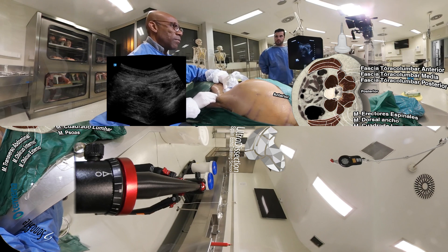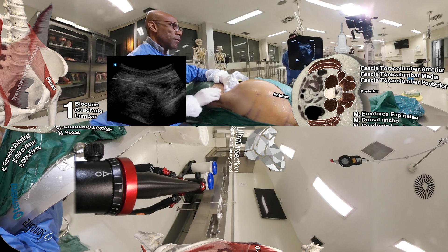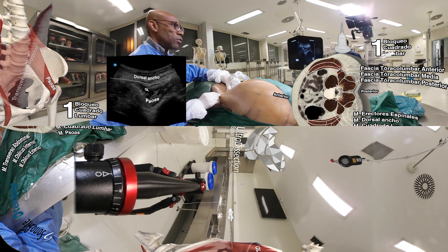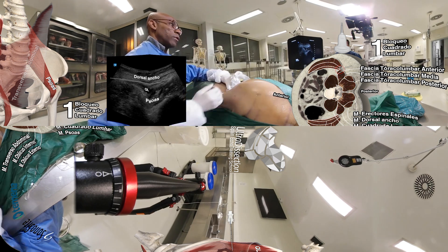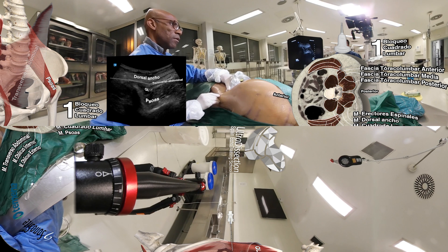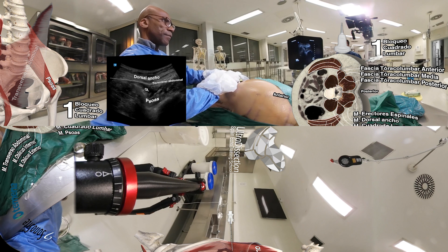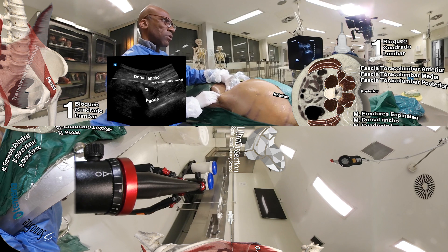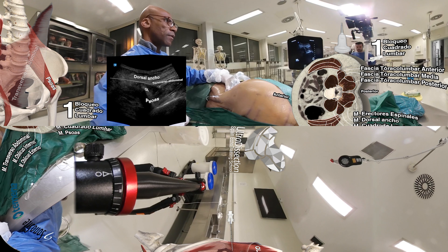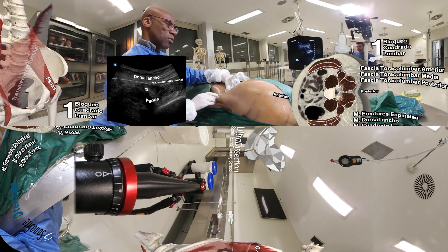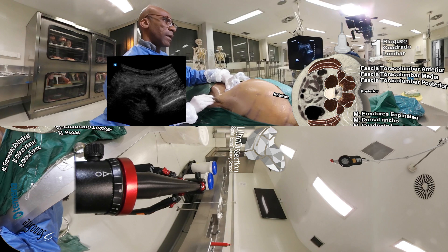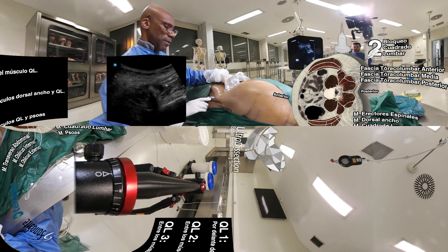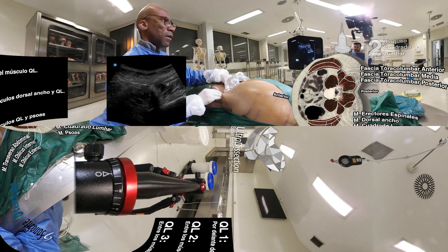To summarize: lumbar quadratus Type 1 is anterior to the quadratus lumborum muscle — here we have the anterior abdominal muscles: the internal oblique, the external oblique, and the transversus abdominis, and here is my needle performing a Type 1 block. Type 2 is between the latissimus dorsi and the quadratus lumborum, and Type 3 is between the quadratus lumborum and the psoas muscle.